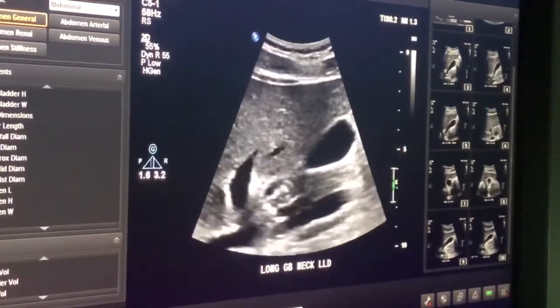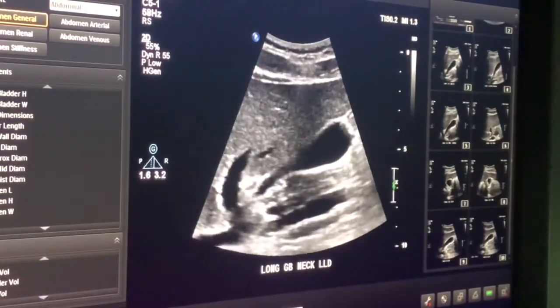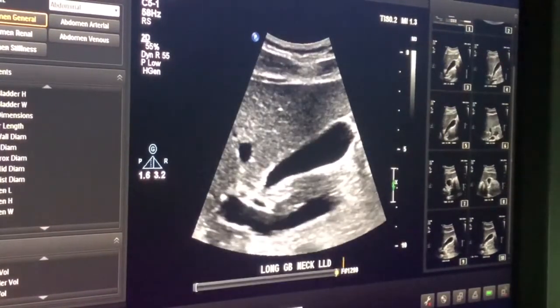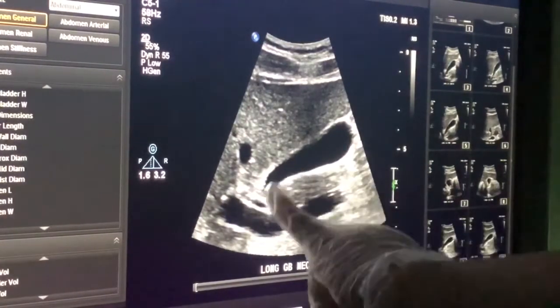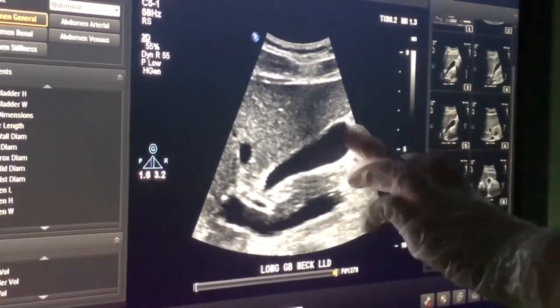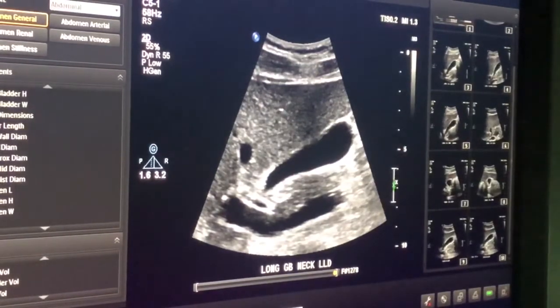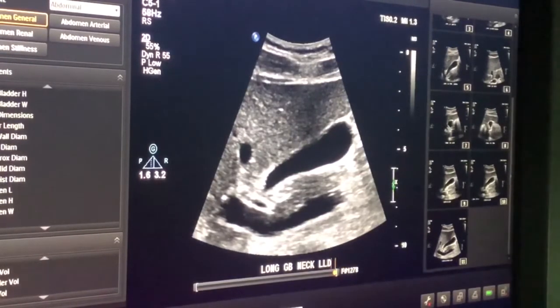Adjusting my focus here. Okay, breathe, patient. So my neck is good, it's elongated here. I was watching my fundus too. I didn't want to make it look like there's pathology or anything in the fundus. It's a nice image of the neck, and the rest of the gallbladder looks good too.